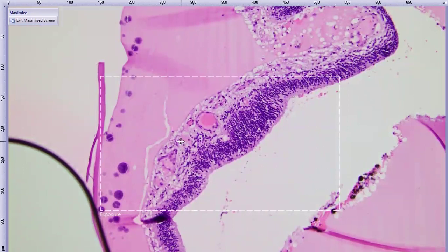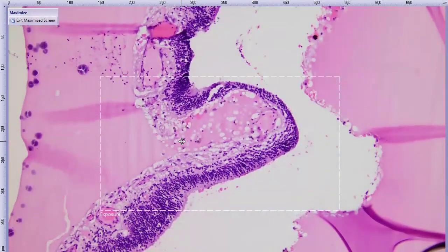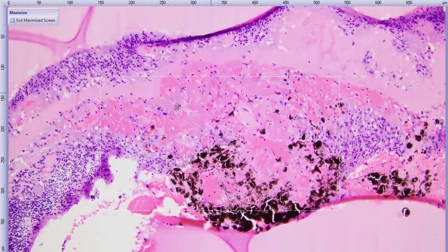So there's variable degrees of both inner and outer retinal loss, but the retina is still recognizable at this stage. When we keep moving, you can see some of that exudation blending in with the retina itself, and all of a sudden it goes kaput, right? So basically retina, and all of a sudden we got red blood cells, and the retinal morphology is gone.